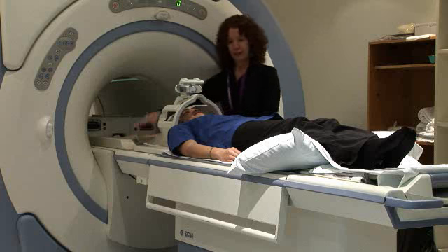Movement is the real enemy of MRI because of the way that the k-space based data is acquired. In a CT, if you move, you might ruin one image, but with the way the data is acquired on MR, if you move, then that may translate through a whole packet of images.